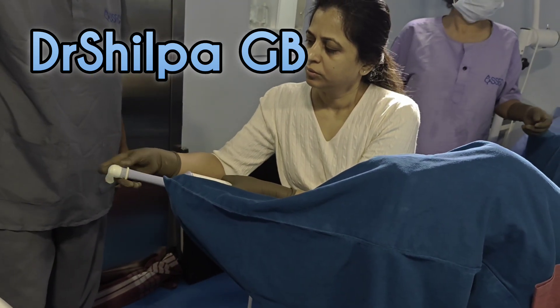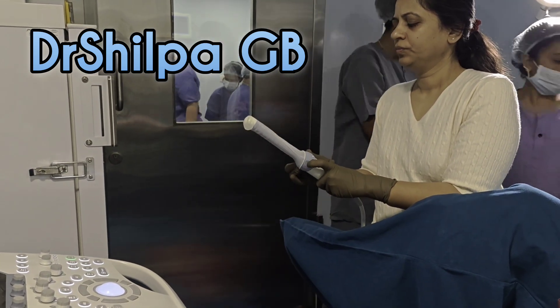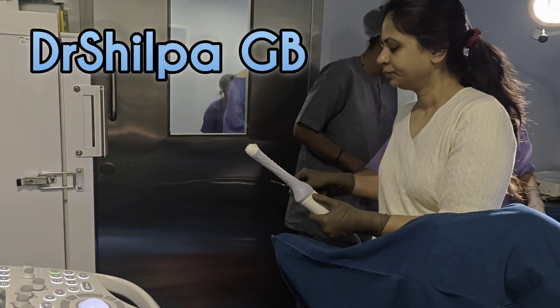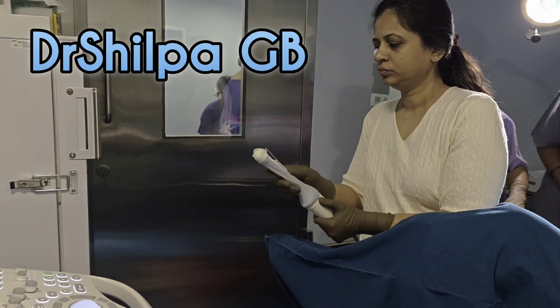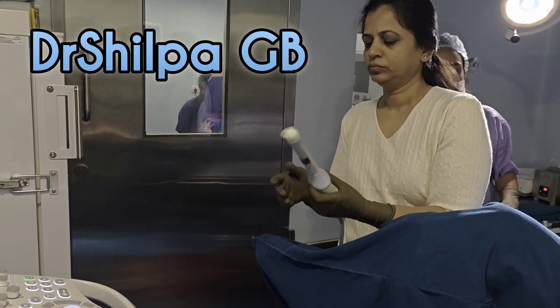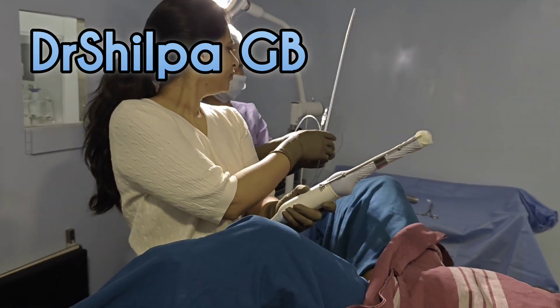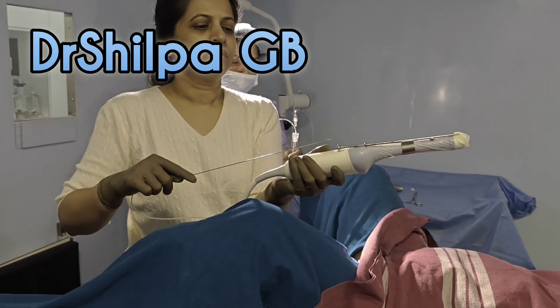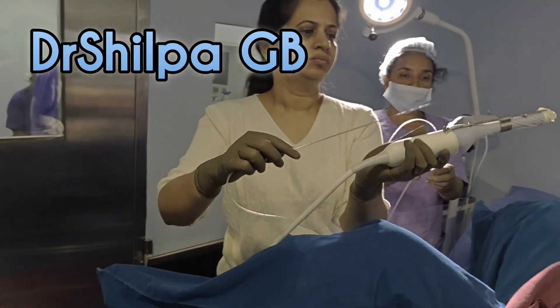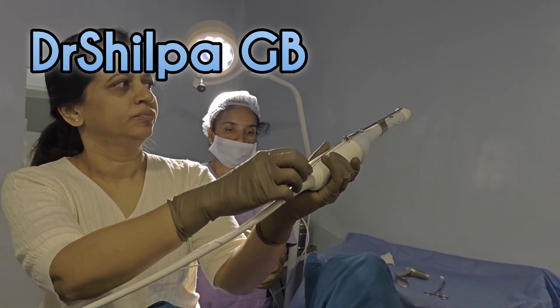This is the transvaginal probe on which I am putting a probe cover. Once I put this probe cover, I will attach the probe guide. This is the guide which has the option to put in the needle which can aspirate the fluid from the ovaries of the woman, who is now under anesthesia.